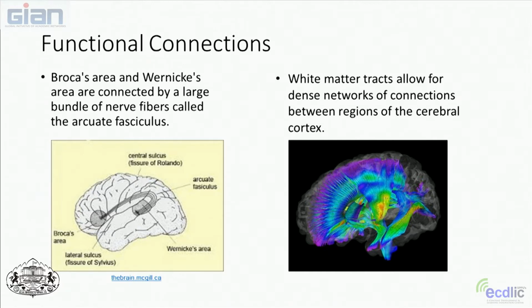On the right side is a picture of white matter tracts. And these white matter tracts are that white part that I showed you inside the brain. And the picture you're seeing there is an image of a newer technology called diffusion tensor imaging. This is a tractography type of imaging, and we're going to talk about it more in a later lecture. But it's a very new technique that allows people to see these connections between the brain and these white matter tracts. They make some beautiful pictures with them.